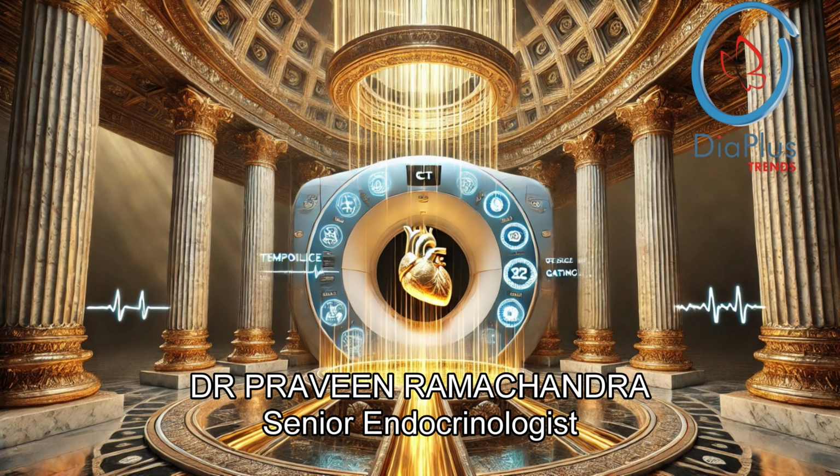Yeah, absolutely. And it can't just be about the power of the scanner. It's also about the timing. Timing is crucial, and that's where ECG gating comes in. This technique synchronizes the scan with the patient's heartbeat. So essentially, we're making sure we're capturing the images at the most stable point in the heart's cycle. It's like having a conductor leading an orchestra to make sure of perfect timing, and to make sure we capture the whole performance.